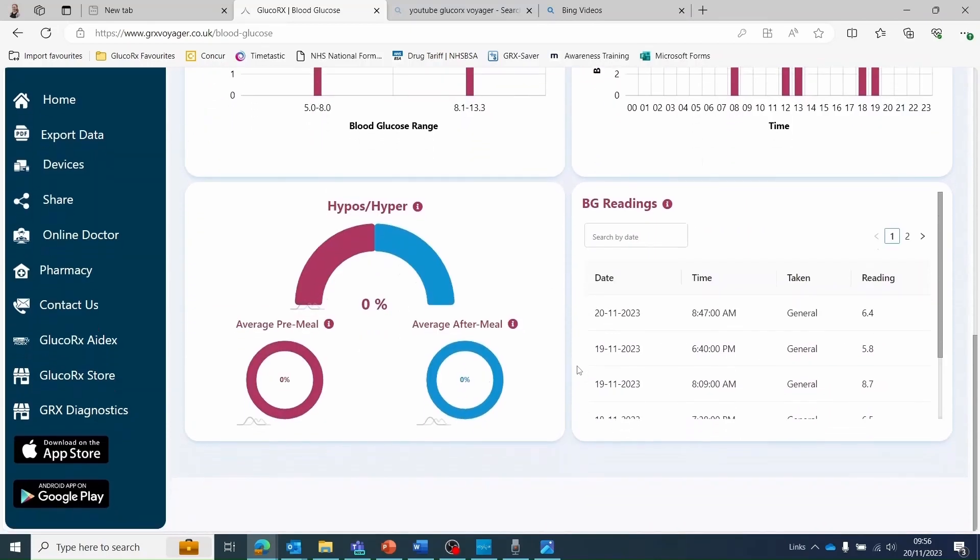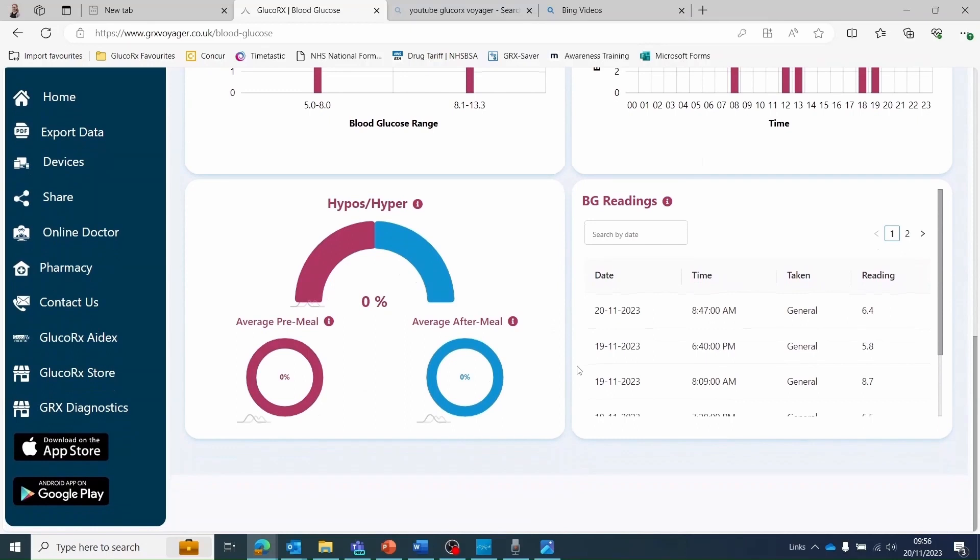The two pie charts at the bottom, pre and post meal, are used to show the readings that have been meal tagged prior to taking your blood glucose test.